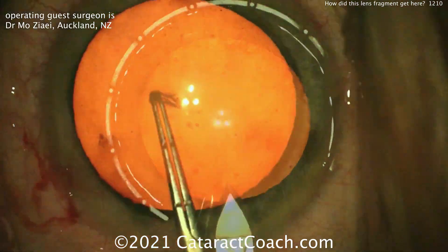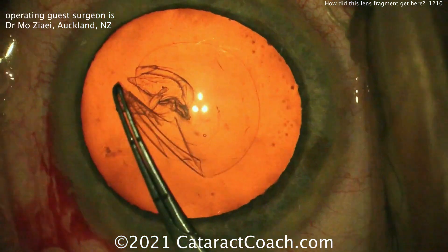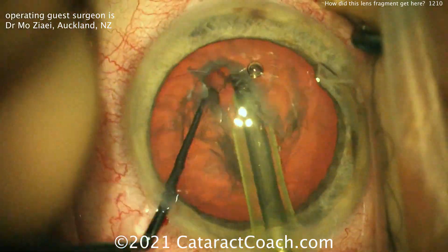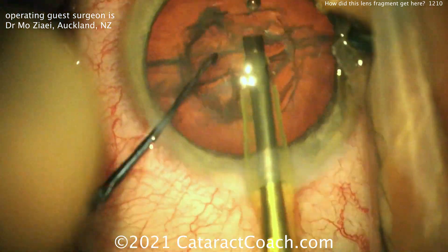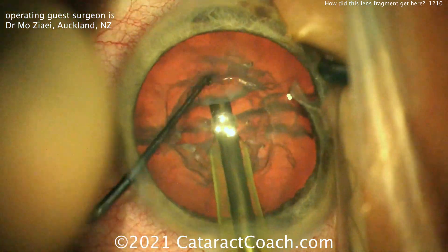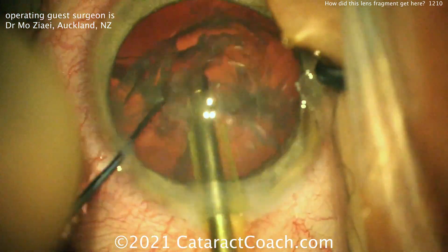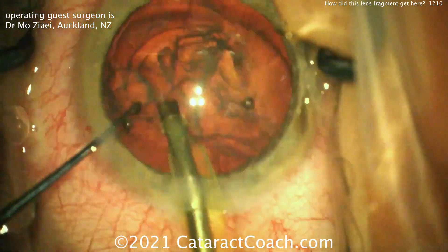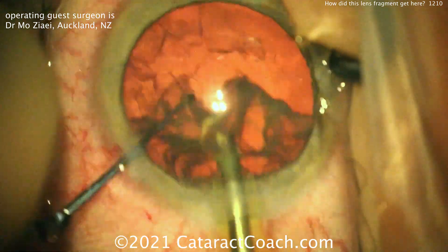You can see a routine case here — nice incision, fast-forwarding through it, getting a beautiful rhexis. Everything looks fine. That's a beautiful rhexis, by the way. Splitting the nucleus here looks like divide and conquer, no stop-and-chop technique, removing the nucleus very efficiently. Everything goes great. There's no complication here at all. Everything looks nice. The zonules look normal.